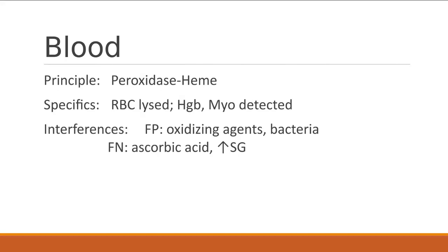So this is where two of those key terms come in, hematuria and hemoglobinuria. This is where we're talking about diseases, or what's occurring, when you're looking at the blood strip versus the microscopics. There's two of the diseases that you need to know, two of your terms. And when I talk about knowing diseases, you don't necessarily have to know anything about them yet. That doesn't come until Module 3.